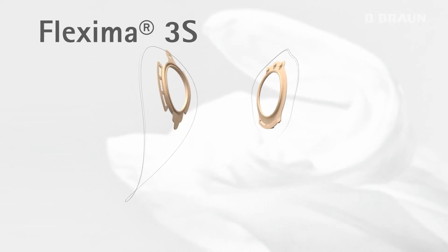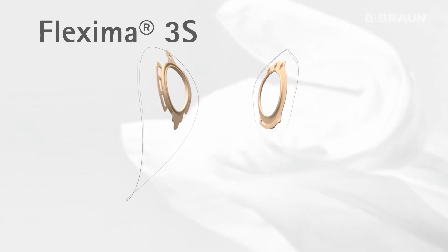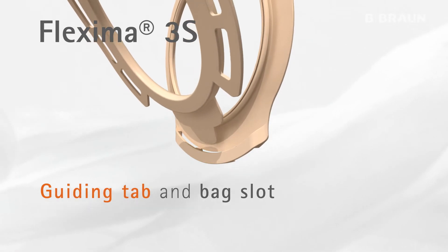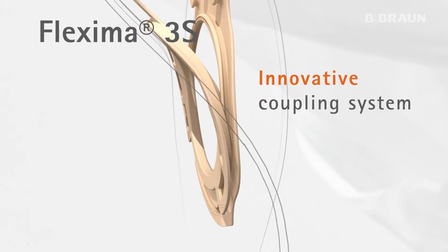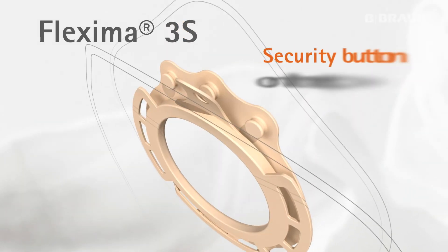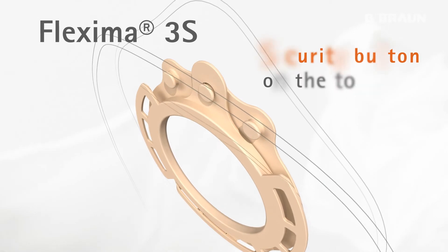The Flexima 3S system consists of the following new features: capitalization on the successful guiding tab for correct positioning of the bag right from the start; a floating flange, enabling the fingers to slide under and avoid any pressure on the abdomen; and double security, with a slot at the bottom and a locking button at the top of the coupling system.